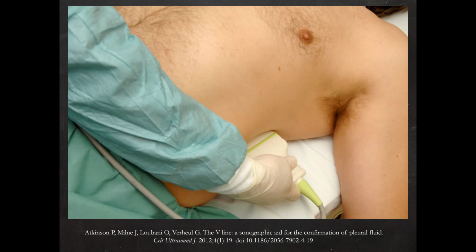When we're actually doing this, I start with my probe at the posterior axillary line in the coronal plane. Getting your knuckles into the bed, especially on the left side, is going to be important here, and this will help you ensure that you're going to be evaluating the dependent space. The thoracic cavity usually divides into the abdominal cavity at a line that extends laterally from the xiphoid process. Perhaps even an easier way to visualize this is to plant your probe right at the lowest aspect of where a bra strap would be.